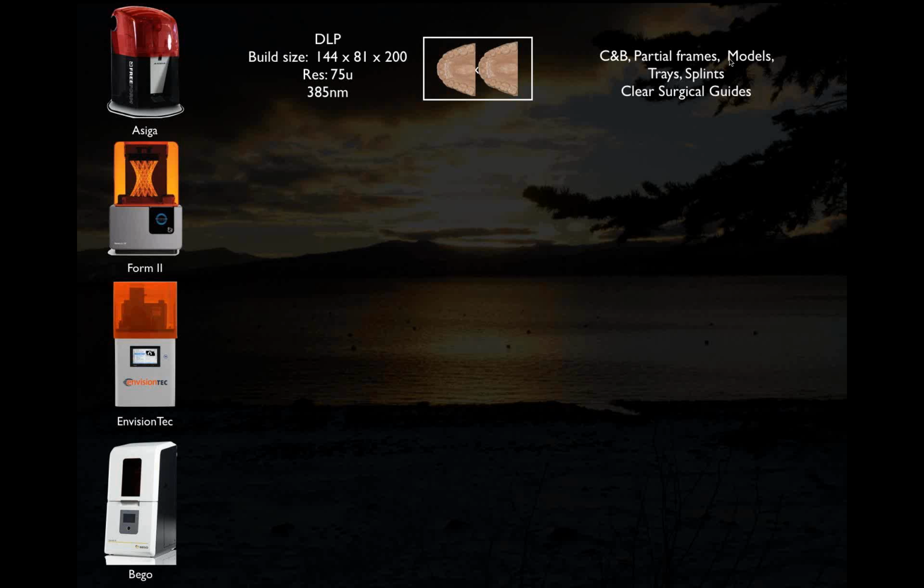It's how many layers it's going to take vertically to build this object, because each layer is exposed in a DLP printer, boom, as one image, and then it moves to the next layer. So really time is based on thickness. In SLA, that is not true, because the laser has to trace around every single object that's on the plate for that layer. So the more things there are, the longer it can take. Just be aware of that, if time's important.